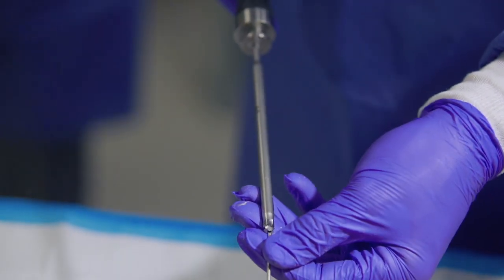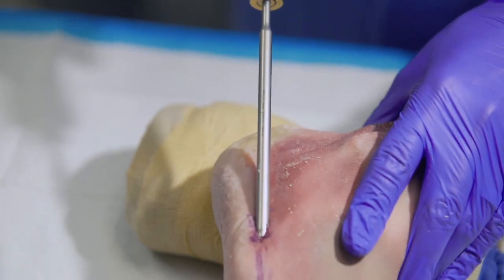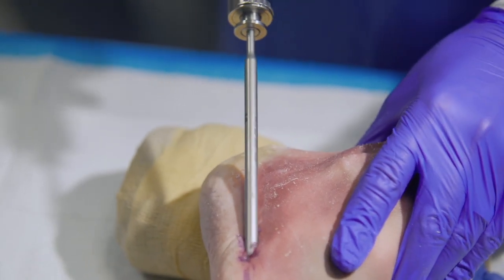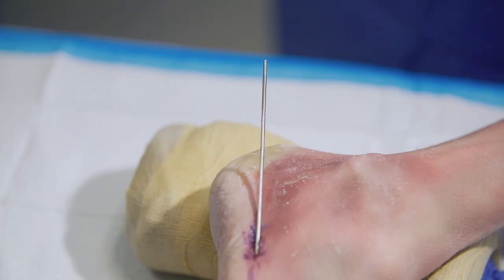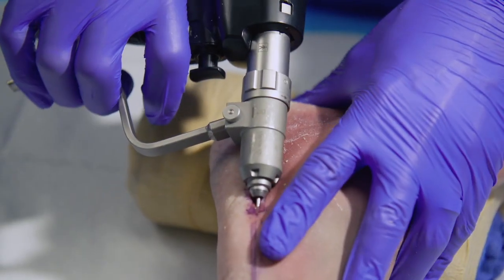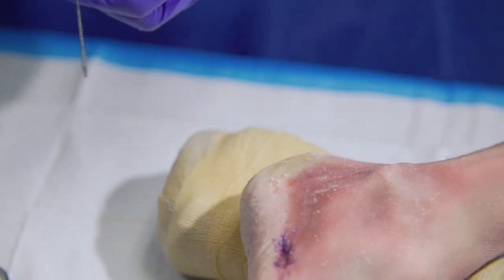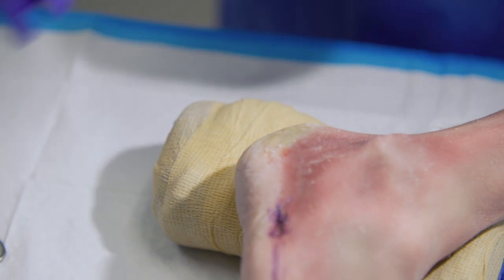Here is an optional countersink for the 5 millimeter screw. In this particular patient, we've utilized cannulated technique. You can utilize a cannulated screw or a solid screw — it's surgeon preference.